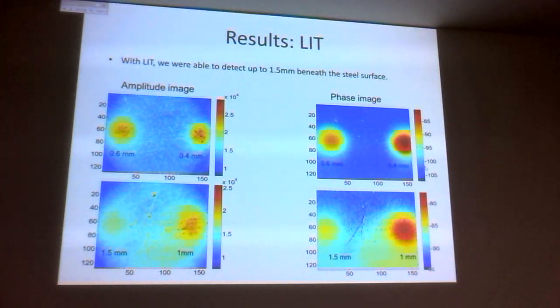For each of these pulses, there's a thermal wave, right? And the thermal wave propagates. So the one that controls the actual resolution is the lowest frequency, because that's the one that produces most of the diffusion. So you improve the method with the truncation to achieve what? Axial resolution or acceleration? I want to do both, but this one here is showing that I'm improving depth capability, so I can see deeper. I can see up to maybe 3 millimeters as opposed to 1.5 millimeters.